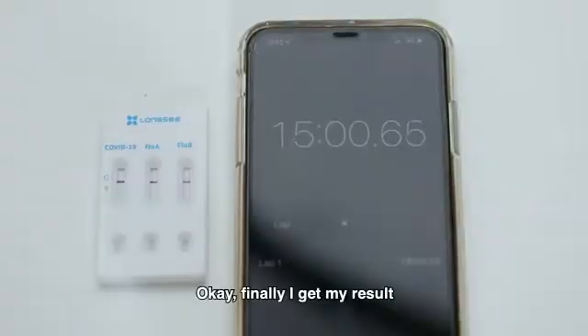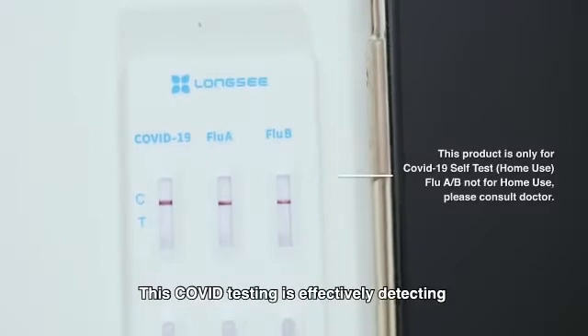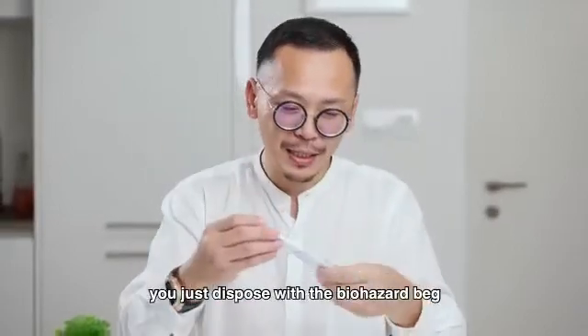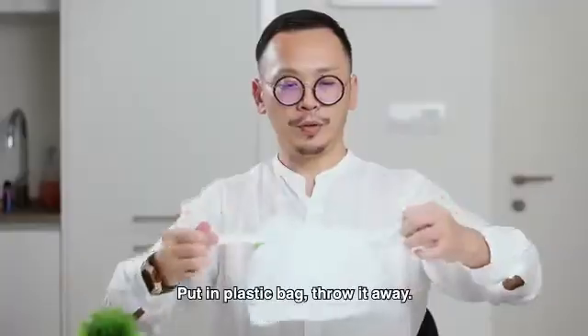So let's see. Finally I got my result — I'm a negative patient. This COVID test kit is effective at detecting mutated variants, for example the Delta variant. So after the test, just dispose everything with the biohazard bag — put it in your plastic bag and throw it away.